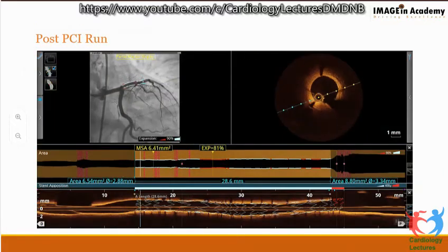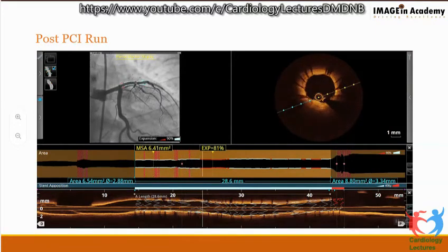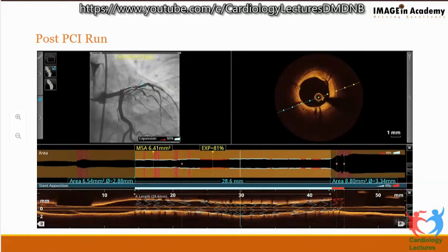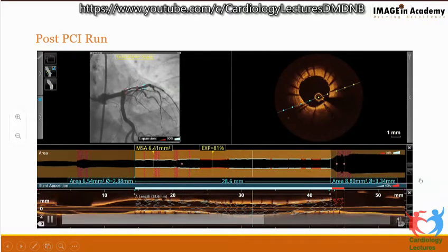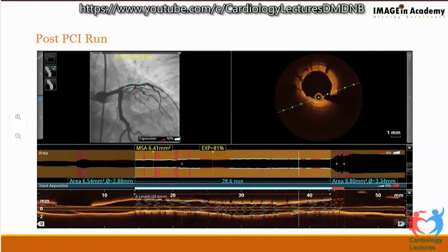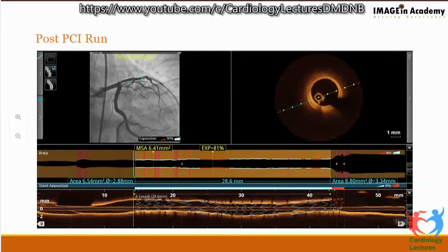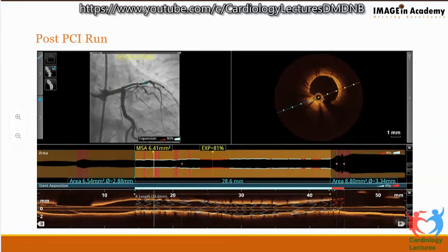And this is one which is taken post PCI. If you can see this, there was absolutely no dissection. Now, a few red markings, which you can see, automatically mark areas that are not expanded well. And I told you these red dots basically indicate branches. In the cross-sectional view, the stent struts appear to be well apposed, except for the proximal part where we are approaching, where it appears the struts are also red. So you will see in the cross-sectional image, the struts are not well apposed.